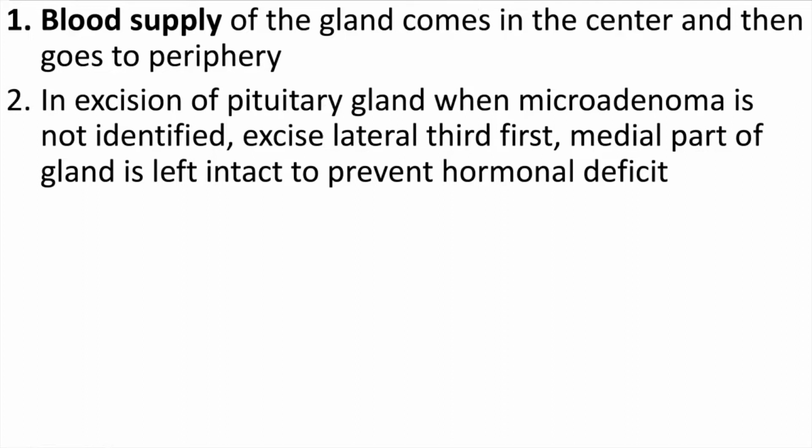So make a nick in the lateral portion and try to see whether there is adenoma in it or not, and then go on to the medial side, rather than making a cut in the midline, because then you transect the blood supply and there will be hormonal deficit.